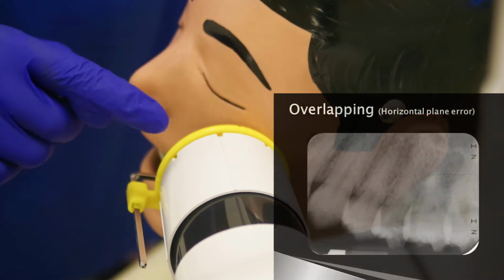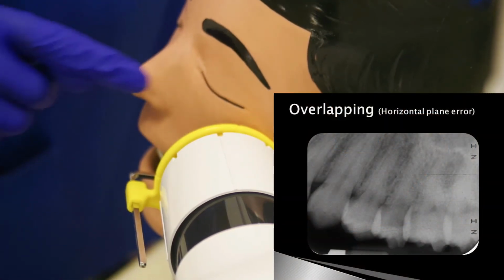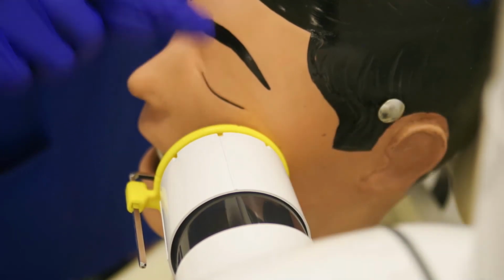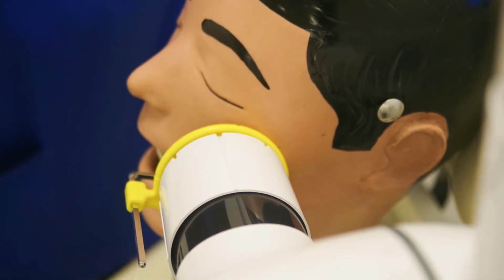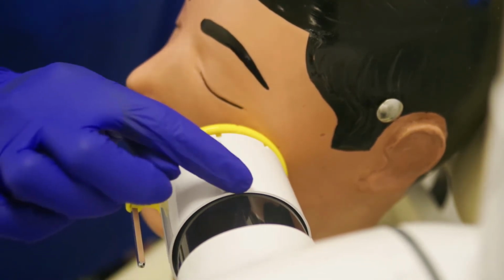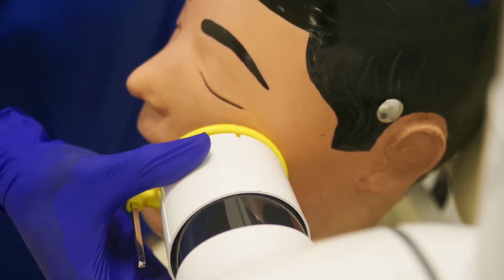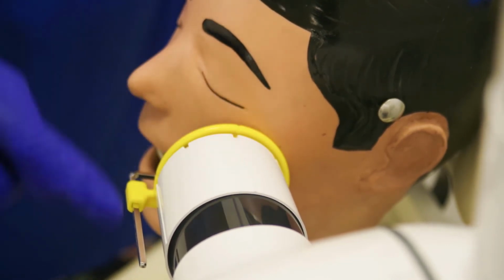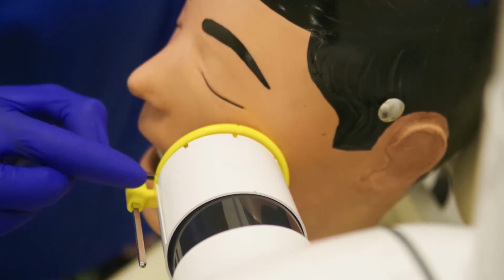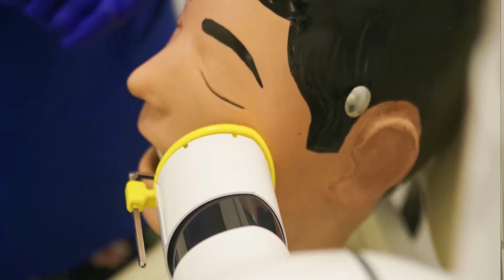Also, if you look at the end of the collimator, it has some notches on there, and you can see that on the ring as well. The ring has notches. So to make sure that your horizontal angulation is perfectly aligned, once you get these lines parallel, you want to turn the notches so that they are nicely aligned as well. So it isn't just these lines parallel, but the notches would have to align with the notches on the ring holder as well.